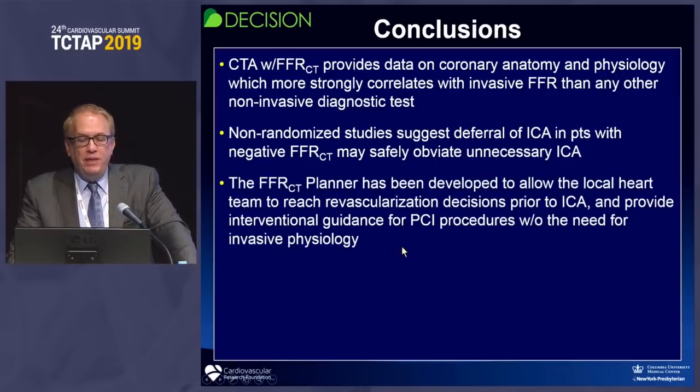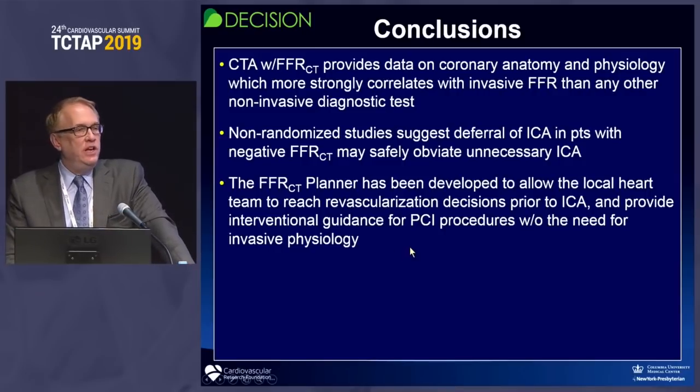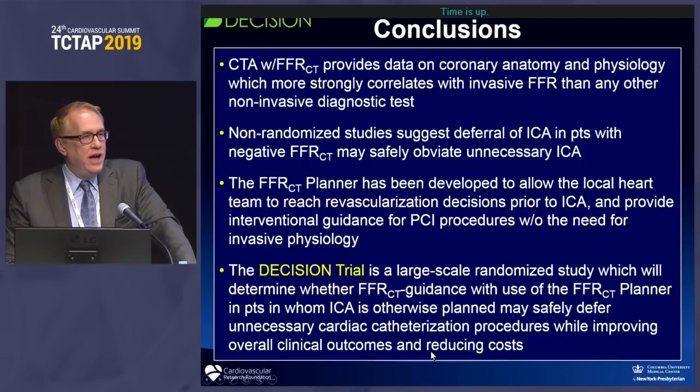The FFRCT planner has been developed to allow the local heart team to reach revascularization decisions prior to angiography and provide interventional guidance for PCI procedures without the need for invasive physiology. And the DECISION trial, which will start later this year, is a large-scale randomized study which will determine whether FFRCT guidance with the use of the FFRCT planner in patients in whom angiography is otherwise planned may safely defer unnecessary cardiac catheterization procedures while improving overall clinical outcomes and reducing costs. Thanks very much.